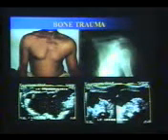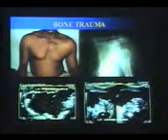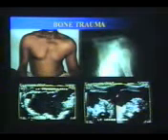Then coming to a situation like this, where we find this man who was having a problem, this arm is absolutely fine, and you can see here, there is a small contour change, drooping, subdeltoid hanging, but this is the X-ray which was seen here. Humerus is absolutely fine, scapula fine, clavicle fine, and this is the cystic degeneration. We don't know what happened. After 3 months, the patient disappeared.